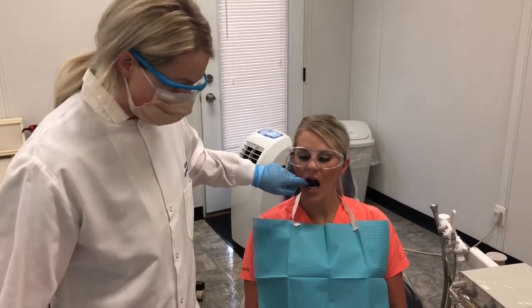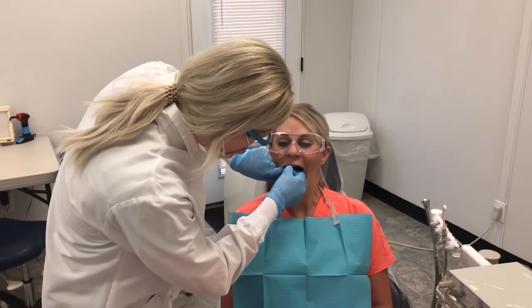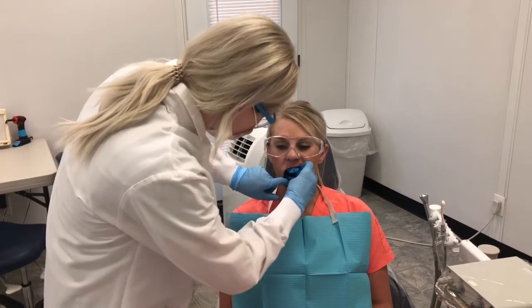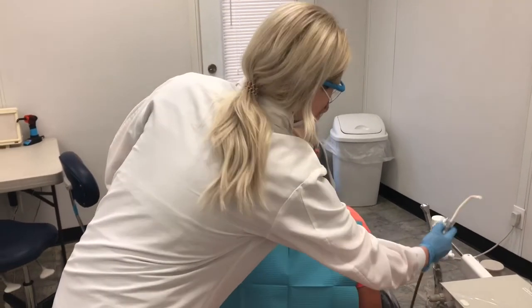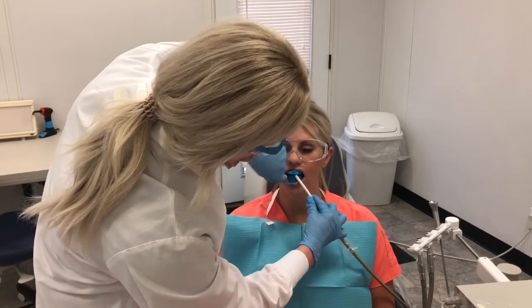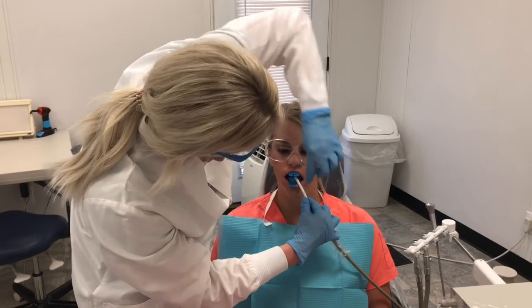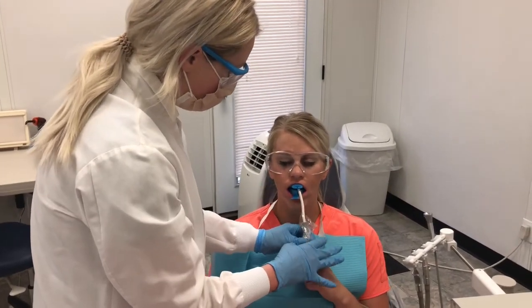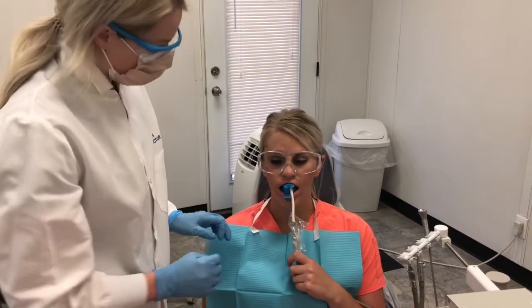I'm just going to have you stay open for me. I'm going to apply the tray, positioning it all the way in the posterior and pulling the lips out all the way around. I'm going to place the suction in here and just gently have you bite your teeth together. I'll pull the lips out to make sure that it fits all the way over the tray. This is going to sit in there for four minutes — go ahead and hang on to that and just gently keep your teeth together.